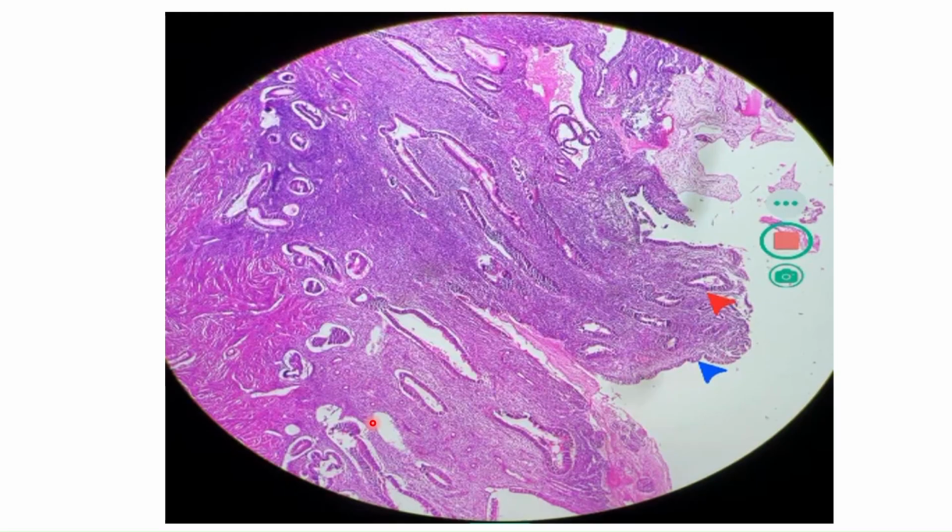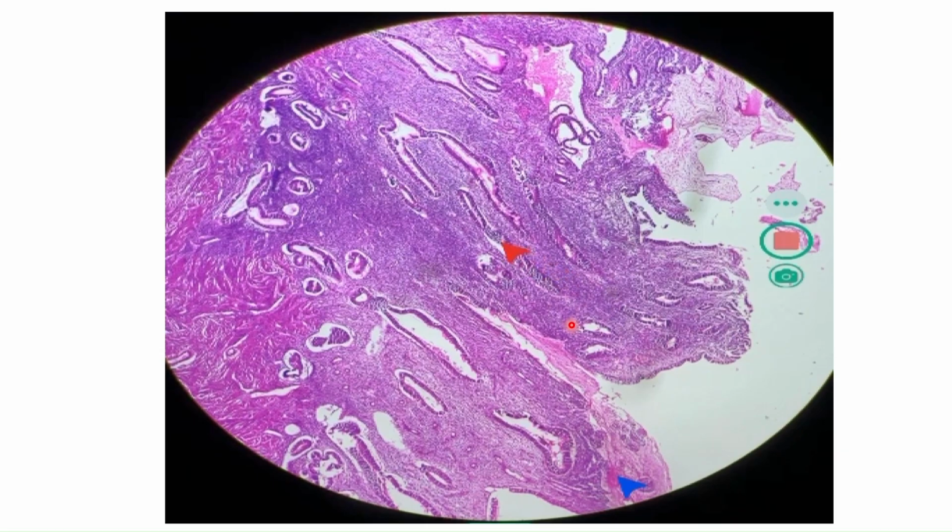So basically, when you view the slide in microscopy, you first identify the surface endometrium. Then this is the stratum functionalis. In the secretory phase, this portion is called stratum compactum, and this is stratum spongiosum. This is the stratum basalis layer, and the glands here show a perpendicular arrangement to the surface and basalis, and this is the myometrium.